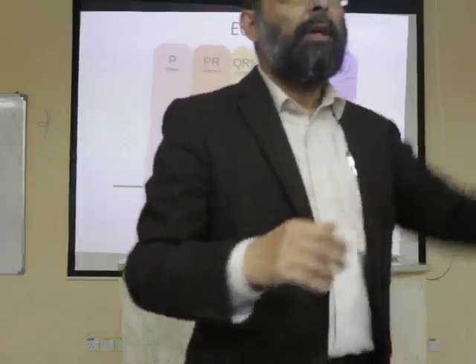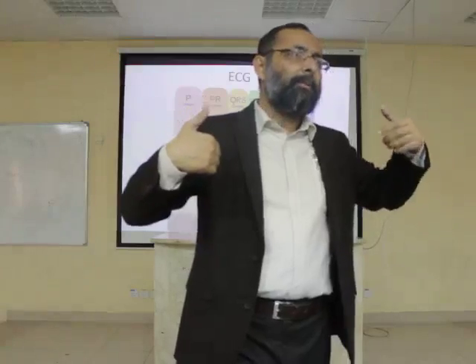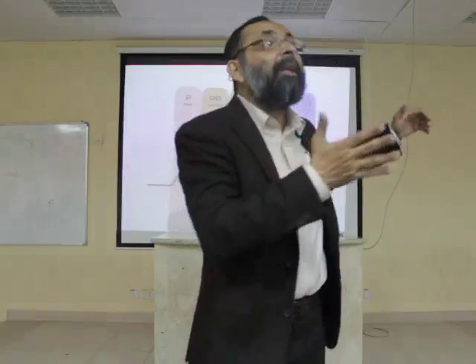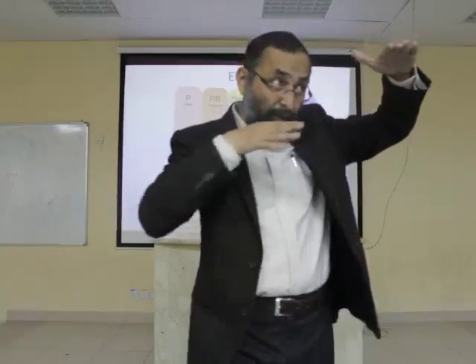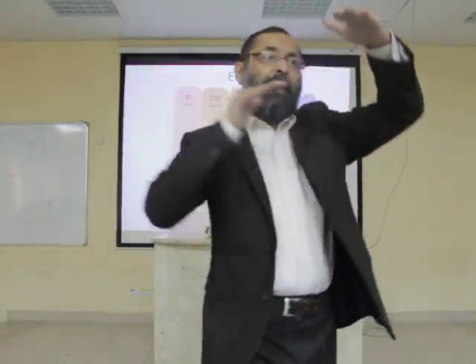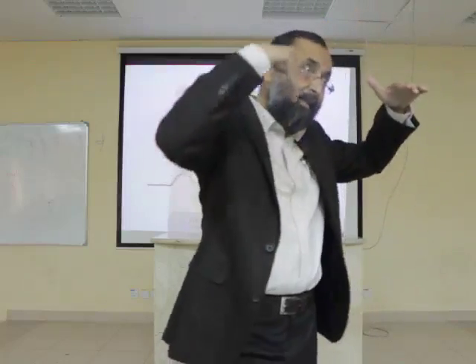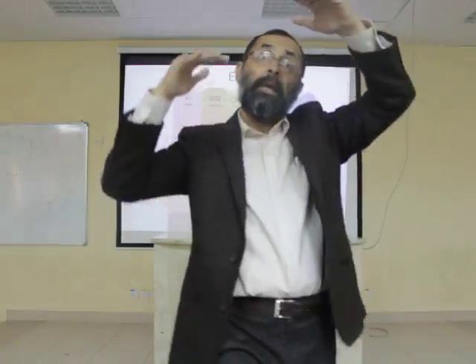But why do we have a positive wave in the ECG? Any lead which is recording has a positive electrode. If your cardiac electrical activity, or the depolarization wave, is traveling towards the positive electrode, you will always record a positive wave. If it is moving away from the positive electrode, if your cardiac electrical activity is running away, because that's a very complicated activity, changing the shape, then you will have a negative wave.